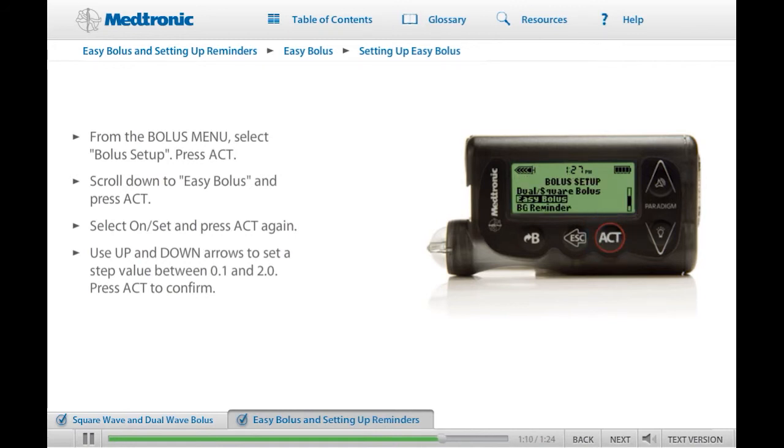Your Easy Bolus feature is ready to use. If you would like to practice Easy Bolus setup, take a moment to do so now. Please ensure that you are not connected to your pump while you practice. When you are ready, click Next to continue.